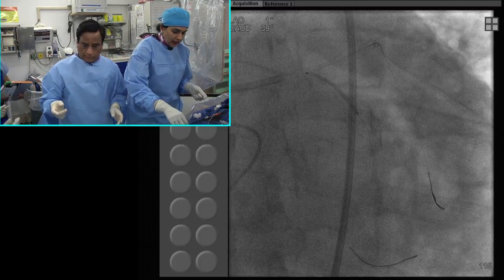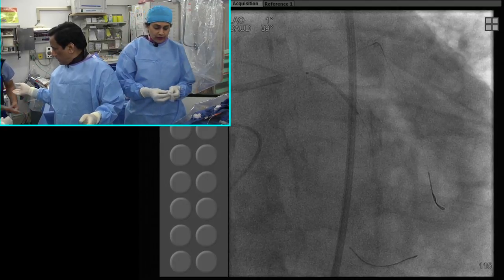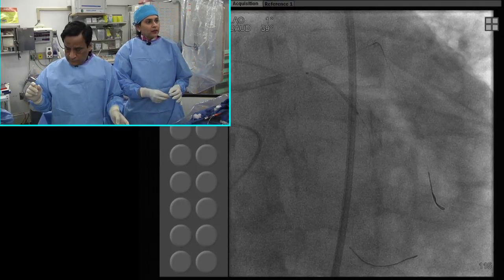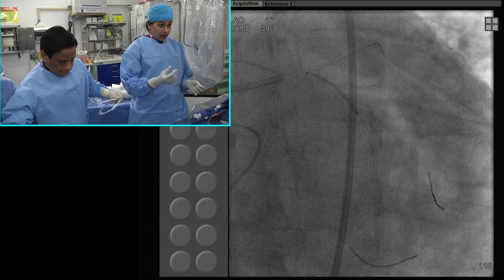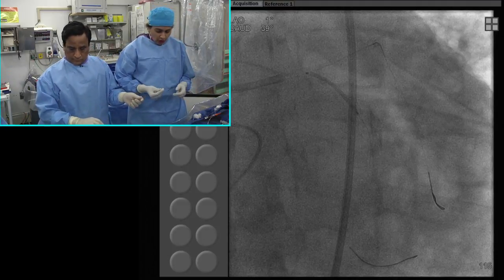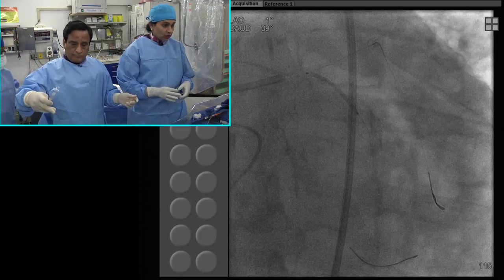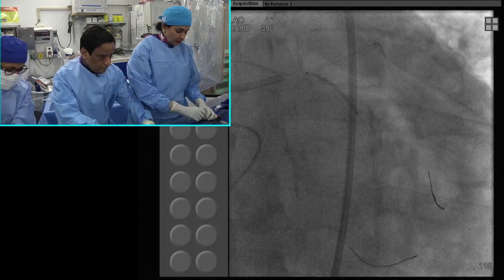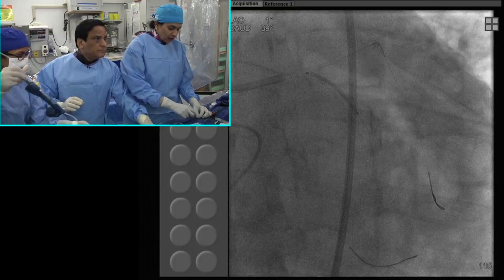Yep. And going to the techniques, I think a two stent technique is definite here, because it's distal left main, large two branches. I think there are probably five techniques we can think of here. You could do a V stent, and if your carina is slightly longer, SKS, or otherwise you could do a culotte, DK crush, or the mini micro crush. That's a mini micro crush is what we are doing in this particular case. You will see a 4020 which has gone into the circ, and then we have a 3528 that's going from the distal left main into the LAD.